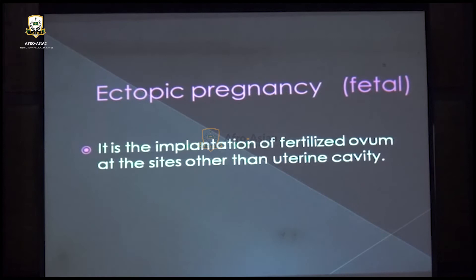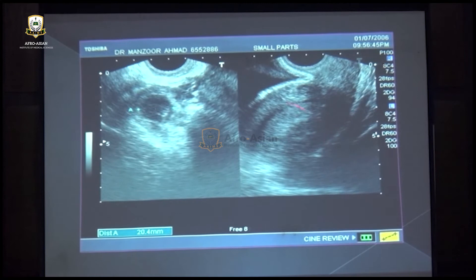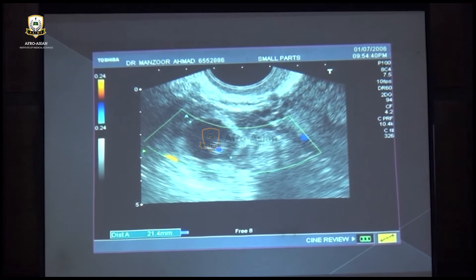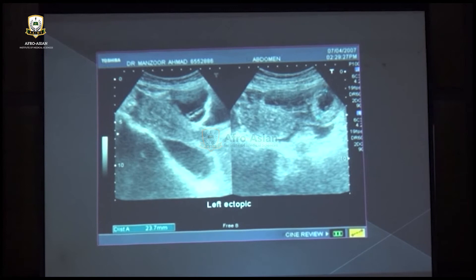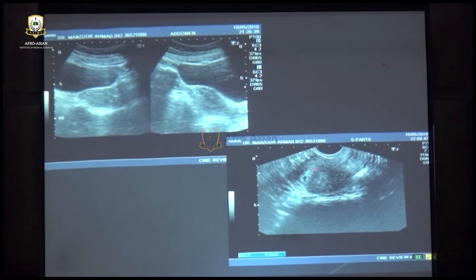Ectopic pregnancy — implantation of a fertilized ovum outside the uterine cavity — shows decidualization of the endometrium and a thick-walled cystic area in the adnexal region. Cardiac activity of the embryo may or may not be visible, but free fluid in the cul-de-sac or lower abdomen is common. Interstitial ectopic pregnancy is implantation within the interstitial part of the fallopian tube; we measure the distance between the sac and the serosa — if less than 5 mm, thinning of the myometrium confirms interstitial ectopic, as seen on both transabdominal and transvaginal scan.